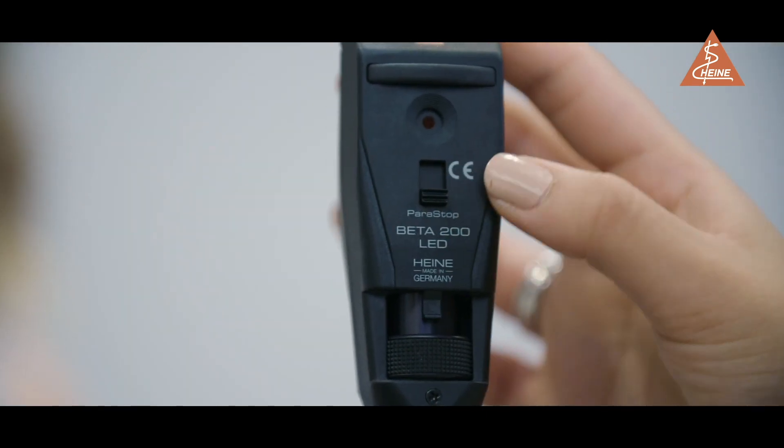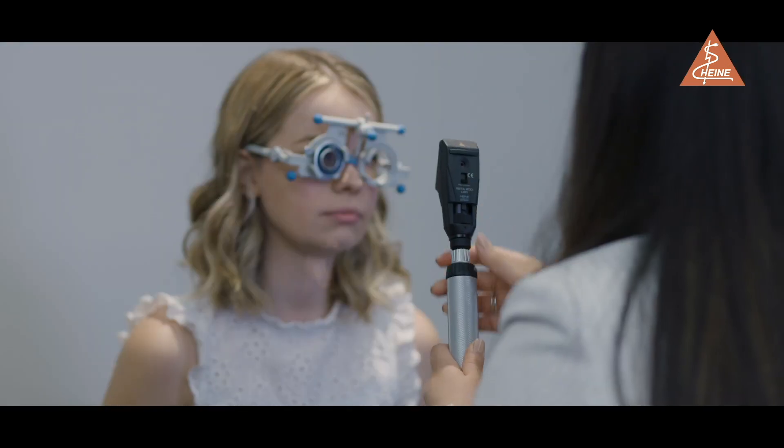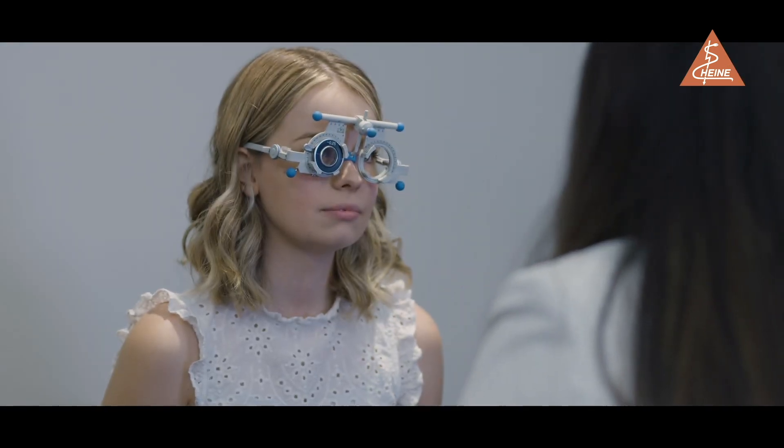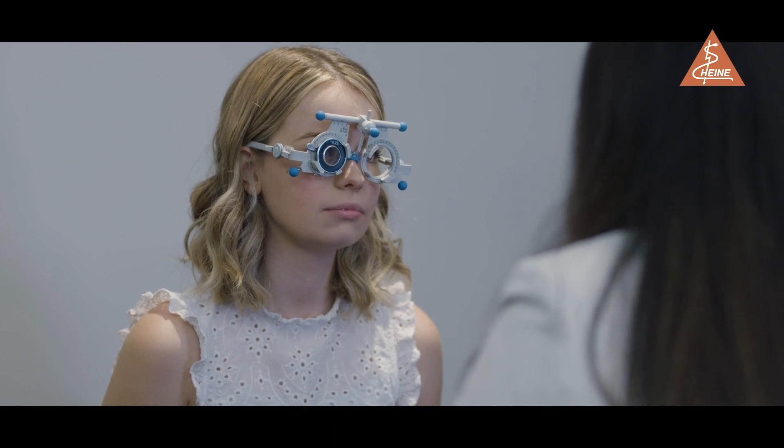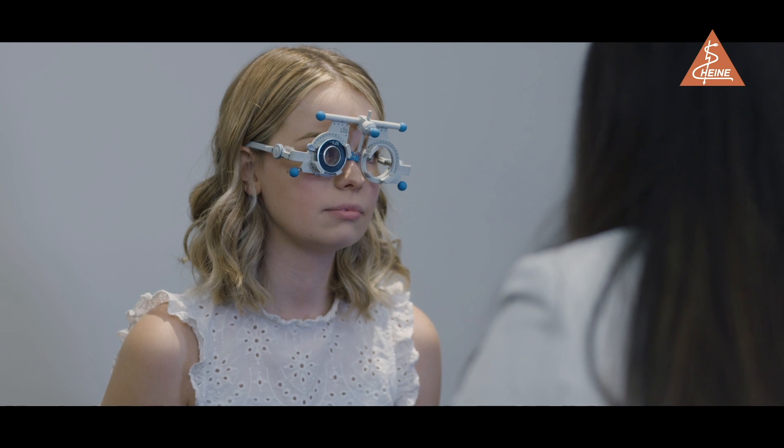When establishing the cylinder axis, I find it useful to use the handy ParaStop on the Heine retinoscope. This ensures the retinoscope beam stays parallel while you are rotating through the different axes, making locating the cylinder axes easier, quicker and more reproducible.